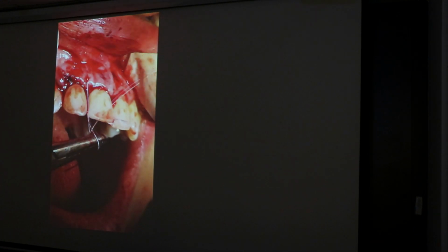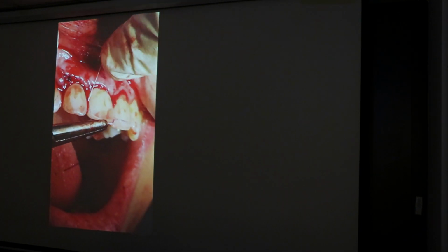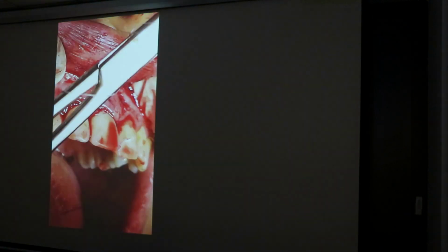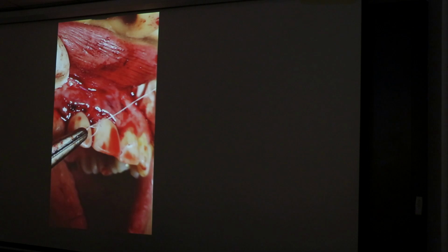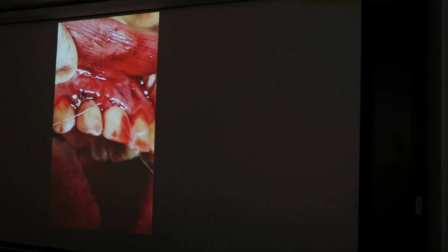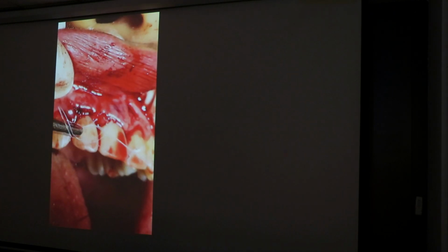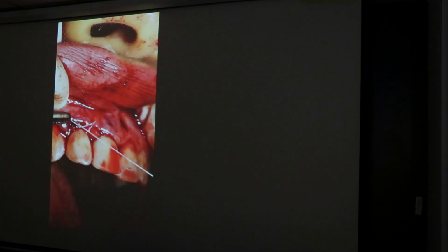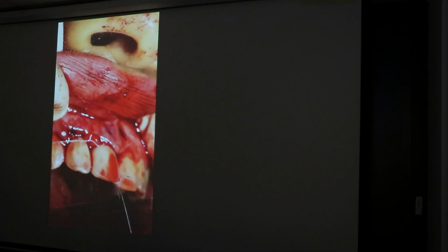What does it mean? How did the bone form? You didn't do bone graft. So the thick phenotype, theoretically also, is a proof that a thick phenotype can create bone underneath. But will such a delicate spot give us bone? I don't know. I hope so. That's what we're doing.